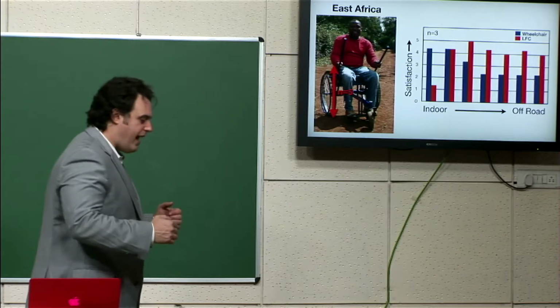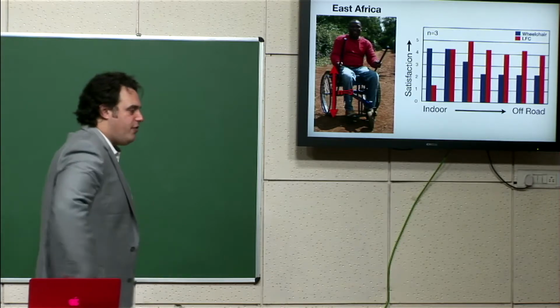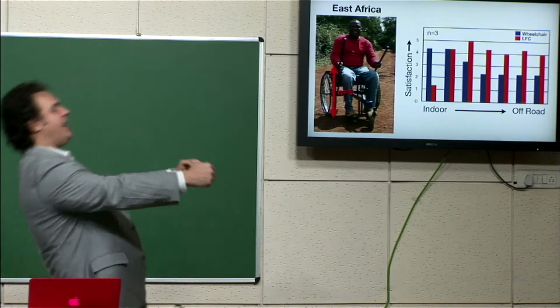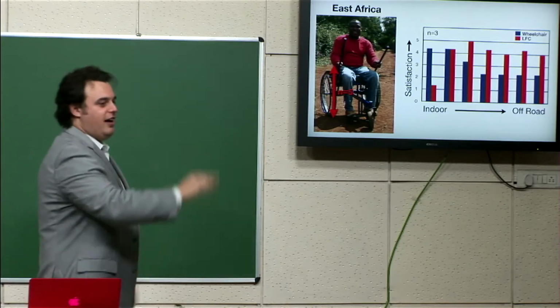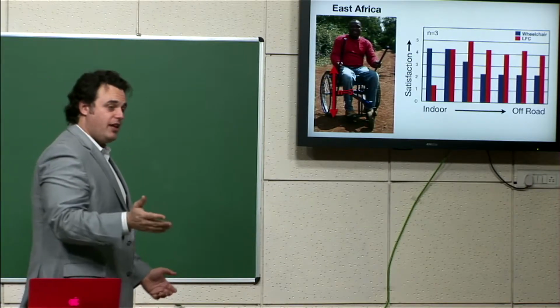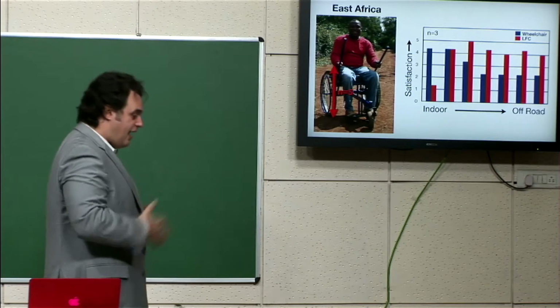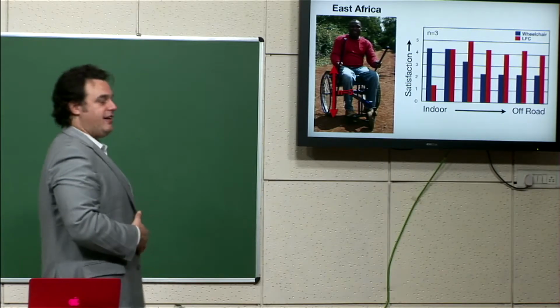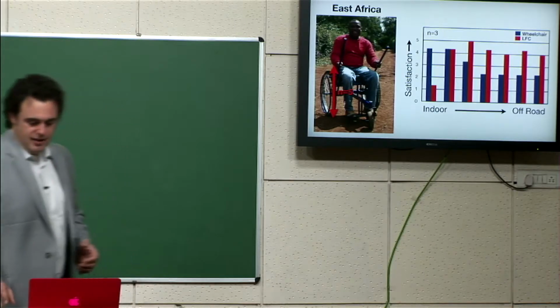So they can't react against it with their abdomen. And so if the back of the chair is too low and they're pushing really hard, their back is going to bend over the back of the chair. It shifts their center of gravity back, and they can flip over more easily. We had not realized this because, me testing this, I have abdominal control. I didn't experience that imbalance and instability.